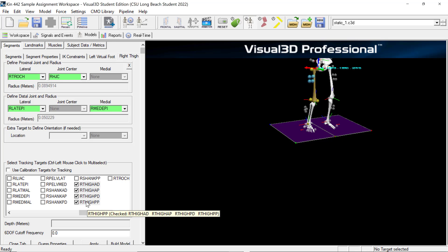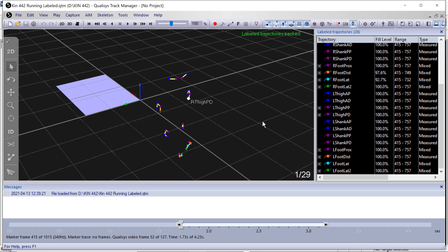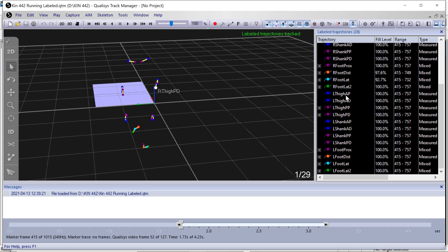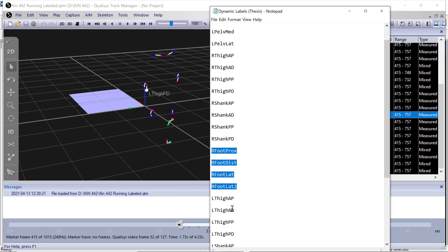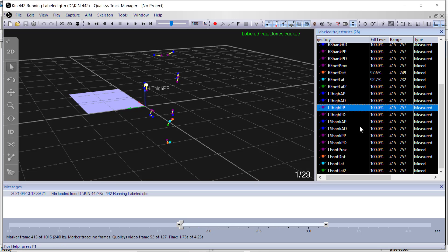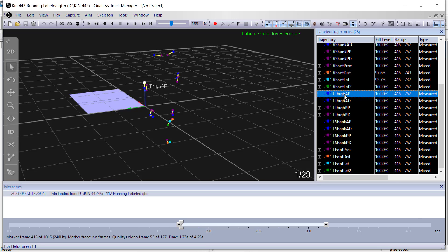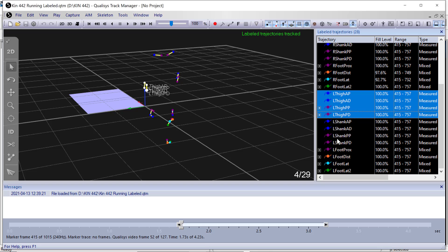The first thing you'll need to do is go to your Qualisys data and go through your trials to make sure the naming is consistent. Make sure the naming on your left and right sides is consistent and the same for your static and all your dynamic trials. If your label is not matching, you need to go through the process of creating your labeled list and then reload it in QTM and relabel those markers. If it's only one cluster, you can just delete those four markers and load up those particular four cluster sets.